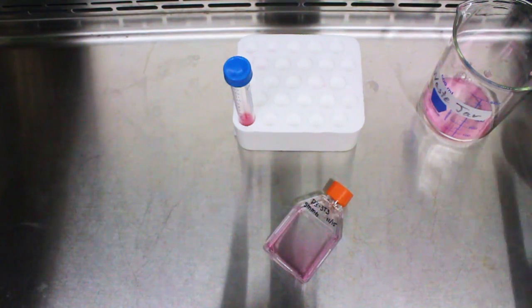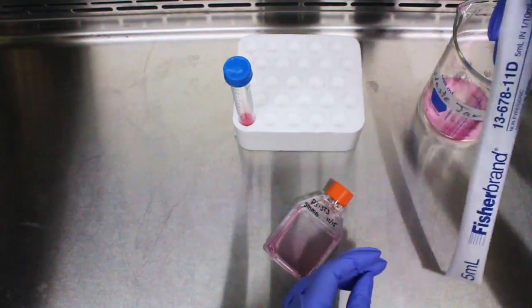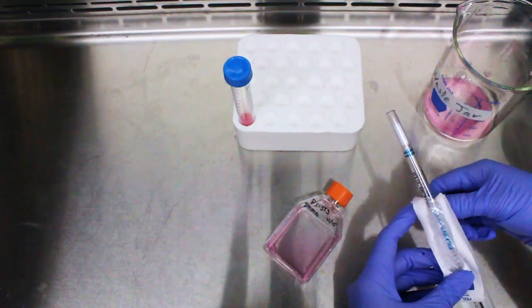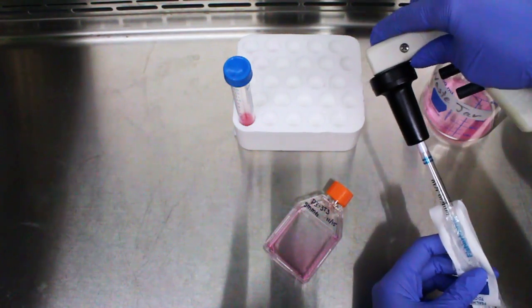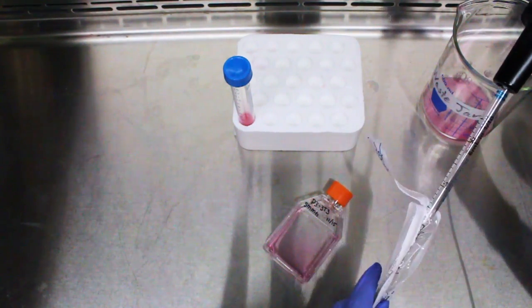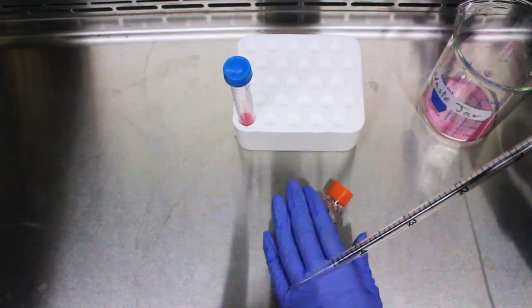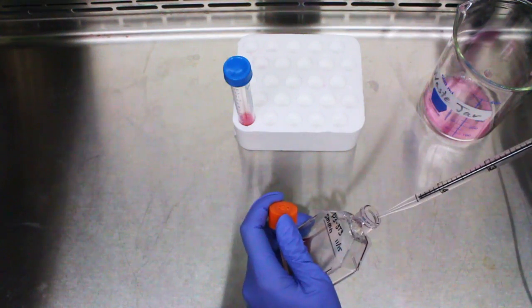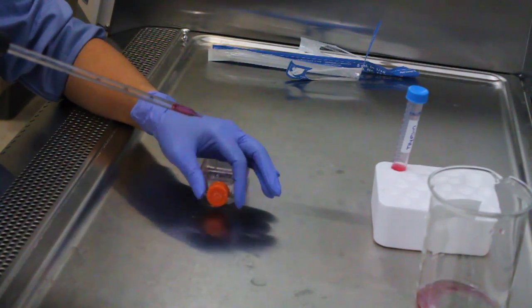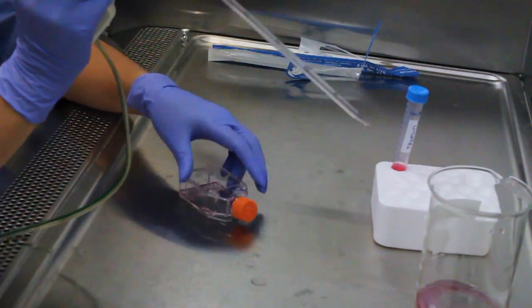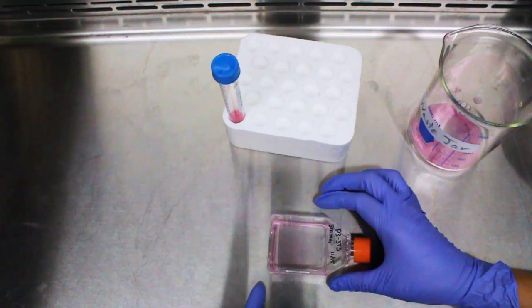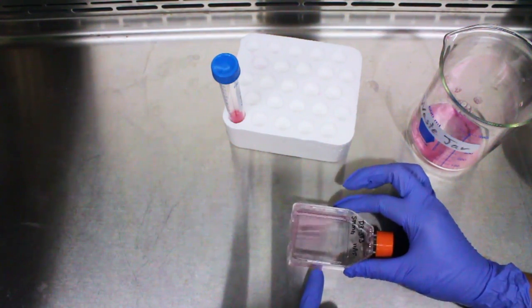After 10 to 40 seconds, remove 1ml of trypsin prior to cell detachment. After leaving trypsin in for about 10 minutes, tap the flask against your finger to make sure that they fully detach.